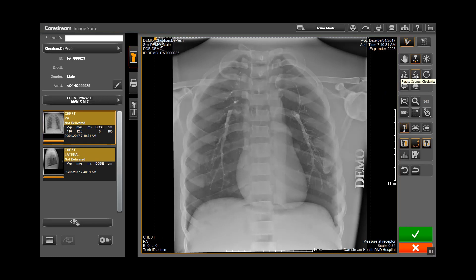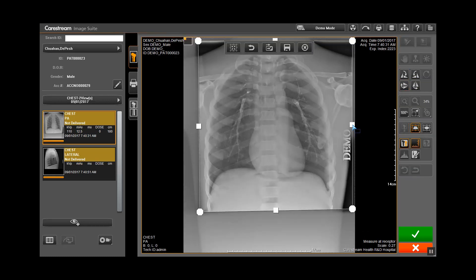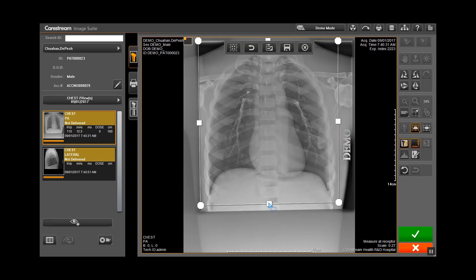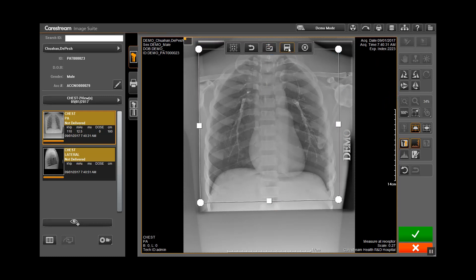Click the BSM trapezoidal icon to the right of the black surround mask. Then click and drag on a point that surrounds the image to make the desired new size or shape. Select the save icon to save changes.